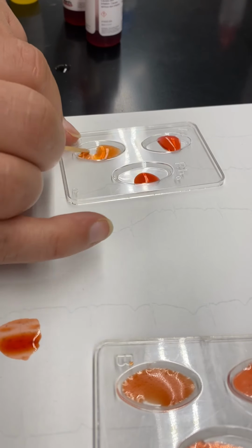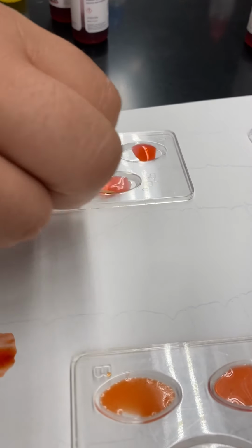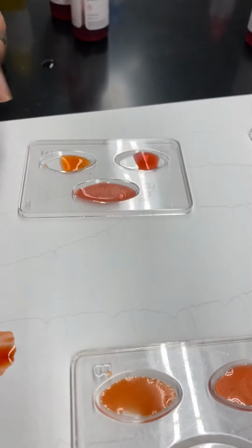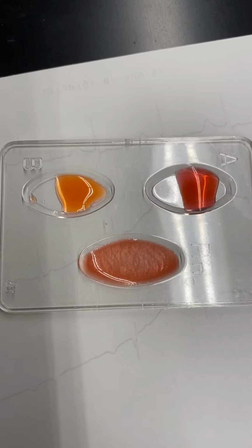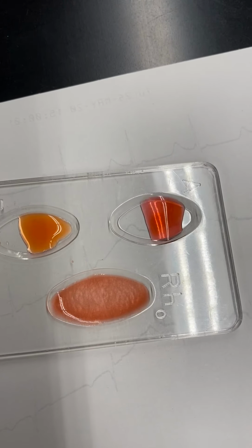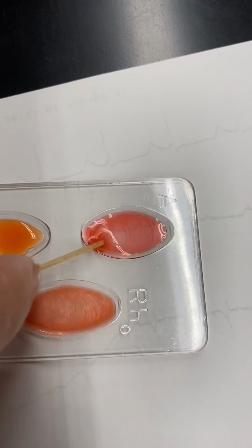So here's our first sample. Nothing is visible happening in there. Here is our second one. There is definitely something happening in there. So you can see a lot of things are forming in there, right? It's almost solidified. And then here is our third blood sample. No visible change here.